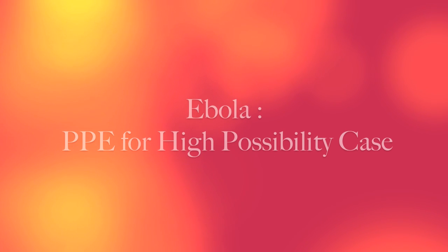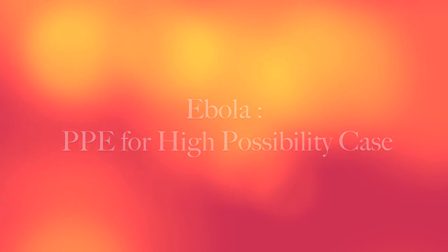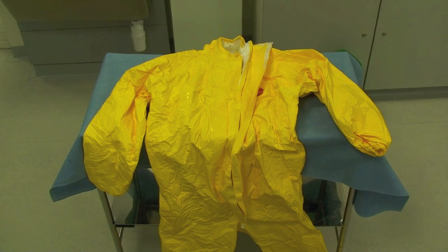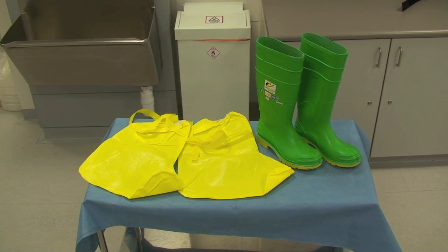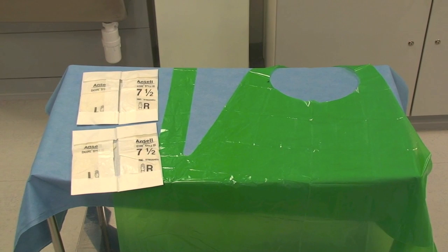We will now look at the PPE for a patient who is deemed as high possibility for Ebola. This includes a water repellent tie chem or micro guard suit, one pair of water repellent overboots and wellingtons if supplied, an air fed hood, a hose and a functioning battery pack, two pairs of sterile gloves, and a disposable green apron.